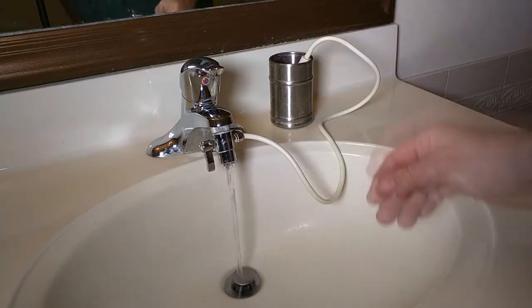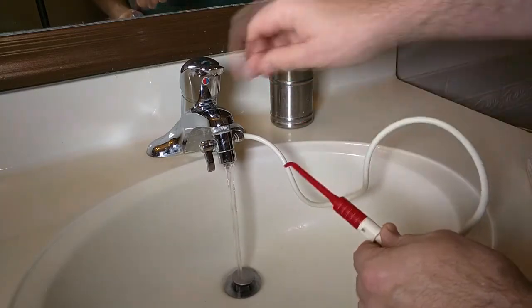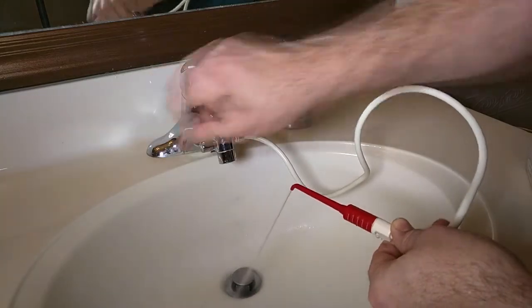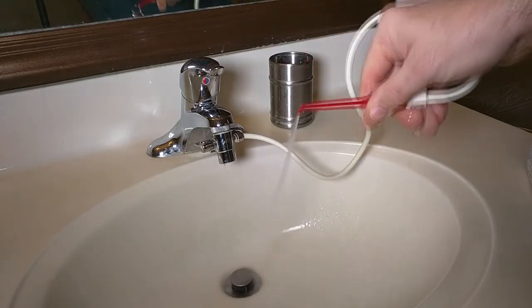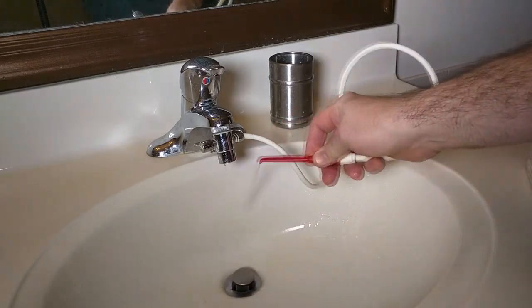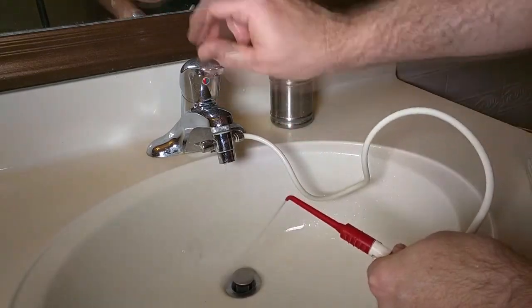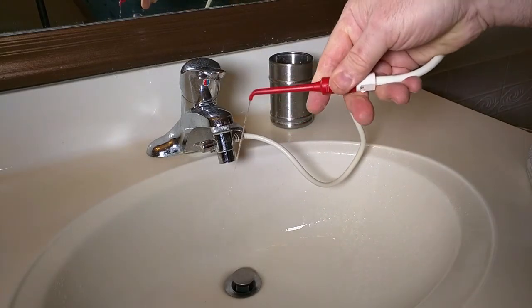You can see nothing's coming out right now. Then when I turn this that way, you get the water blasting out of there. This is a very powerful blast of water, as you can see, and what this does is clean your gums.